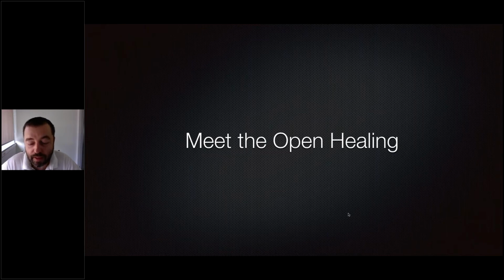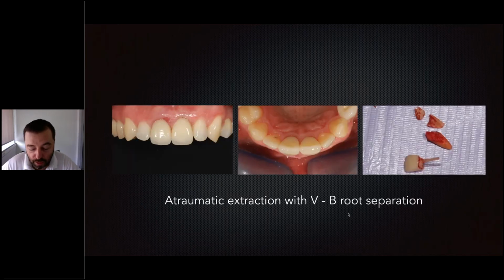Of course, handling an aesthetic zone case is all the time more difficult, but respecting this concept of minimal invasive approach, we can generate a good outcome for future cases. So we had root failure.